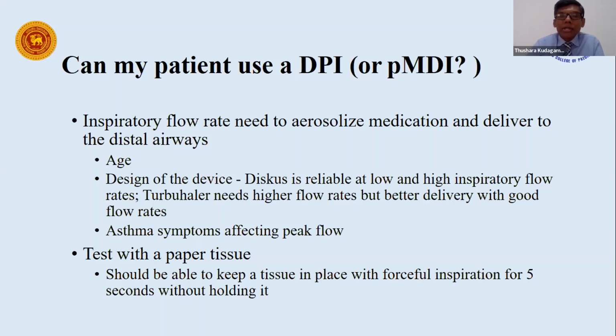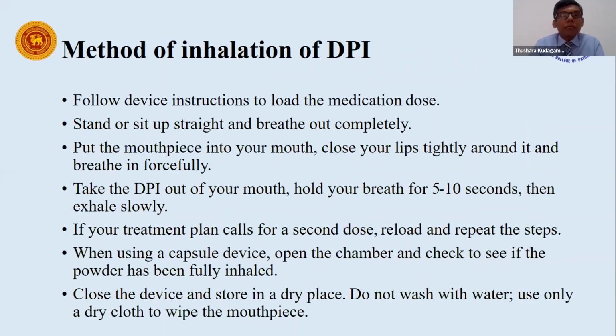Practically, what you can do is use a paper tissue and let the child keep it in place in the mouth by forceful inspiration, and see whether the child can keep it there for 5 seconds without holding it. If the child can do it, probably the child can use a dry powder inhaler.